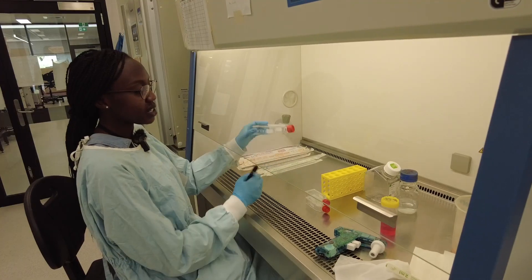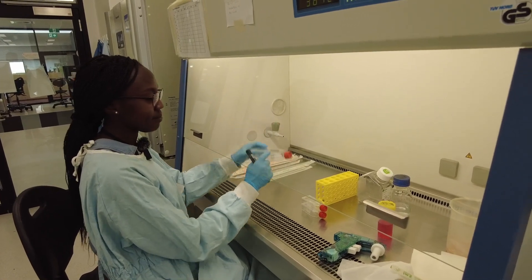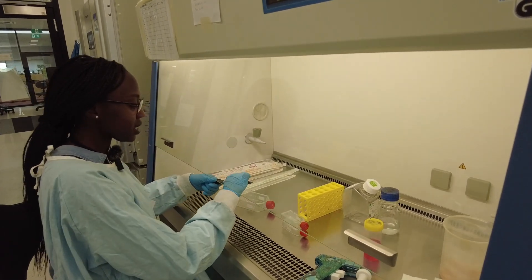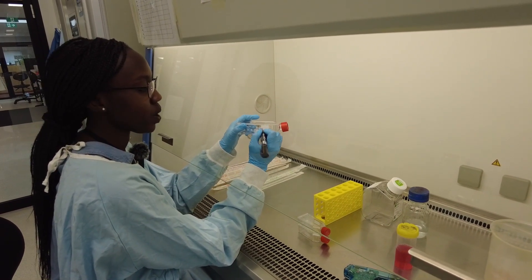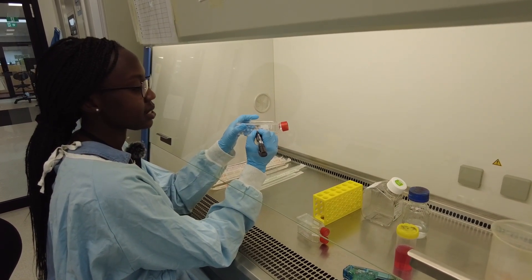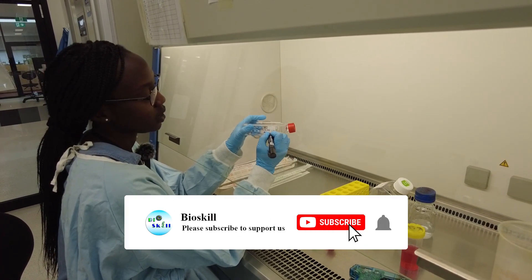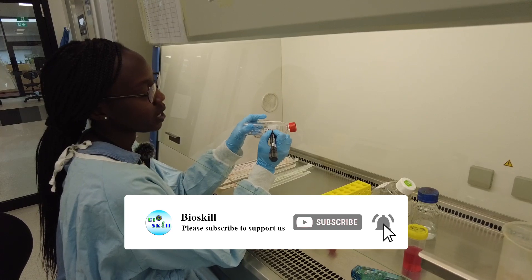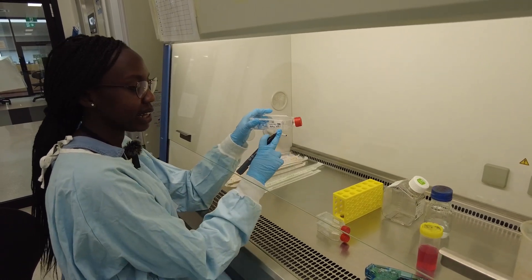So it's important for us to label on the flask what's going inside, the date and our name. So I'm going to label each flask with the name of the cell line. It's called CCD841. Today's date is the 26th of September with my initial and we're going to call this one Passage 3 or the third time we're splitting the cells.